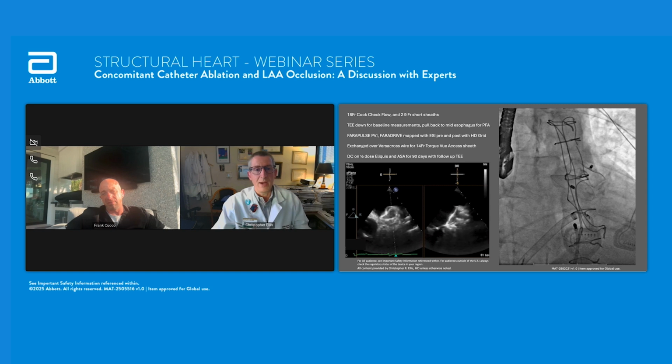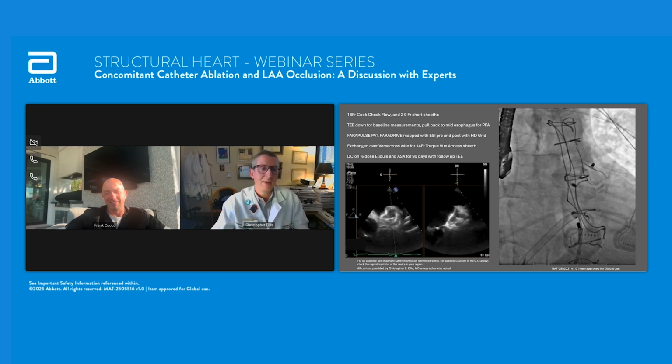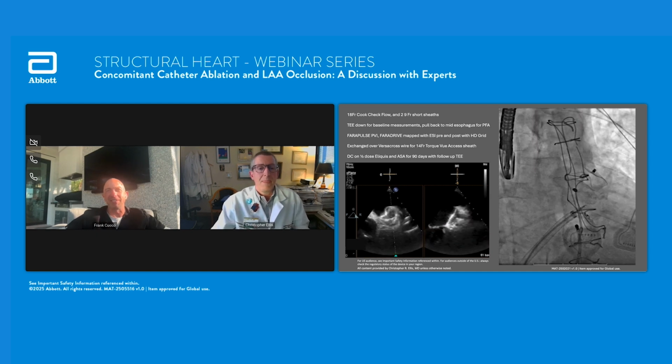I'll go left atrium, ablate, come to the RA, do the SVC. And then when I'm happy that everything's good and we're in sinus rhythm, it's very easy to pop back through the hole. It's a huge hole. Anything is going to drop through it. So no, it's not hard. Crossing the septum is not an issue these days.